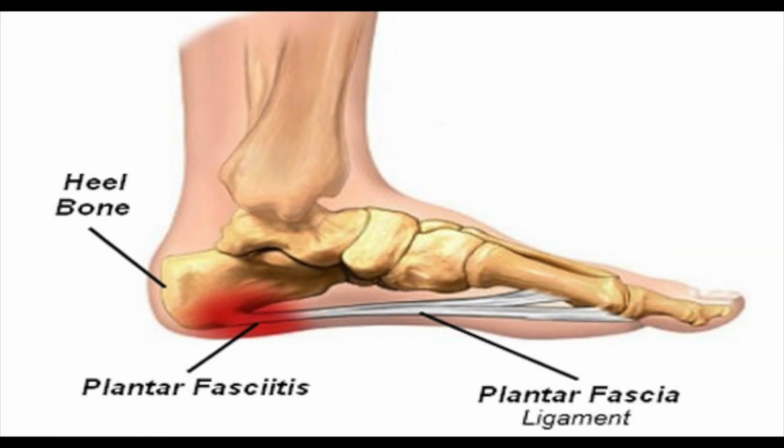So for this one, we're looking at an arch tape job, which can treat an unbelievable amount of different things when it comes to different pathologies. One of the most common ones, as pictured above, is plantar fasciitis, with any issue with the plantar fascia. The nice thing about these arch ones is you can get highly customizable. We'll cover some basic ones in this that we kind of combine together. This can help with different types of potential neuromas just by supporting through different areas.